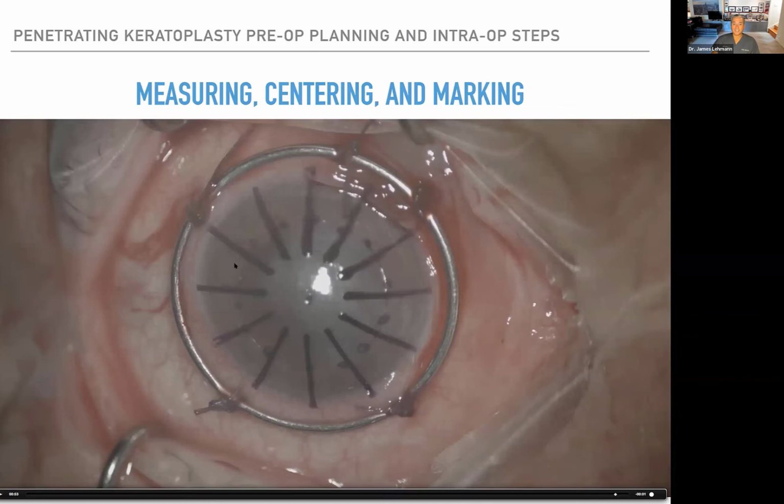Now, this additional trephination or epithelial marking is not necessary, but when you put your trephine on the eye to do the actual trephination, if you can visualize all of these dots inside of your trephine, you know you're centered pretty dang well. You know what I mean? Because it's encompassing the smaller diameter trephine. So again, this is the belt, suspenders, and bootstraps technique where you have a lot of marks, okay?